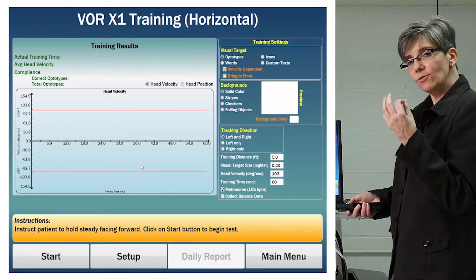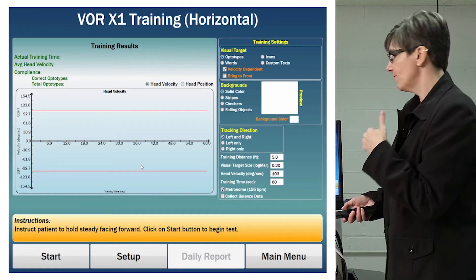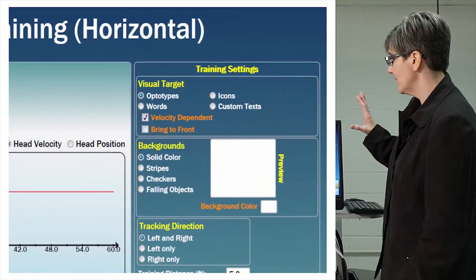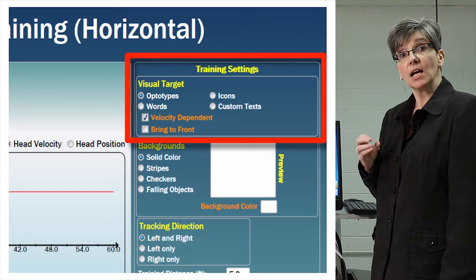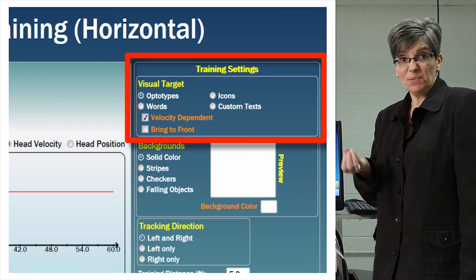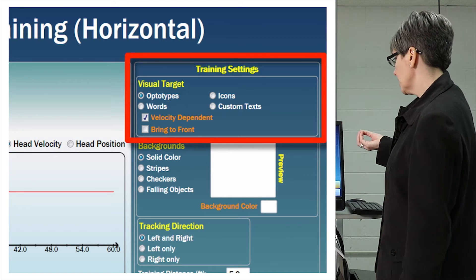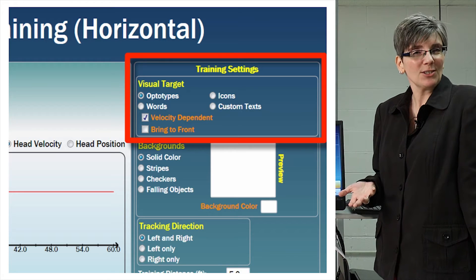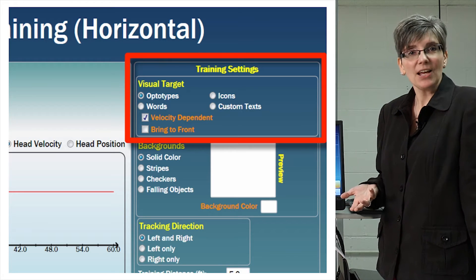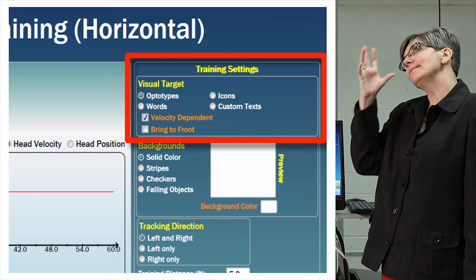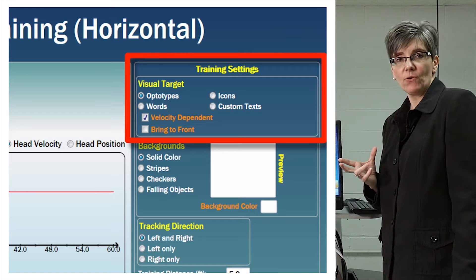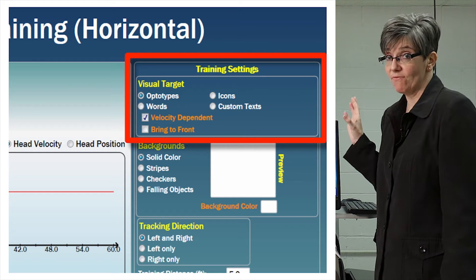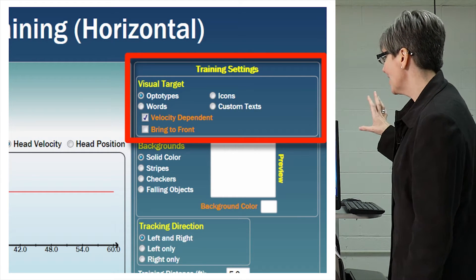When you get into the VOR training screen, we have the ability to train Mary using optotypes — E's, words, pictures, custom text — we can do any type of training that we can create using this very flexible software.